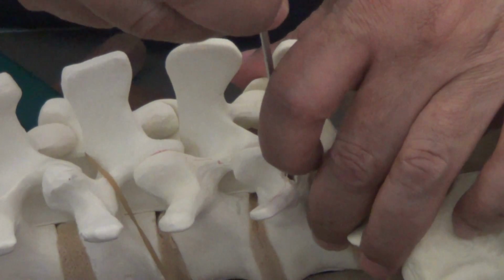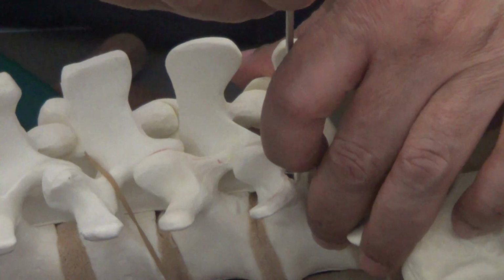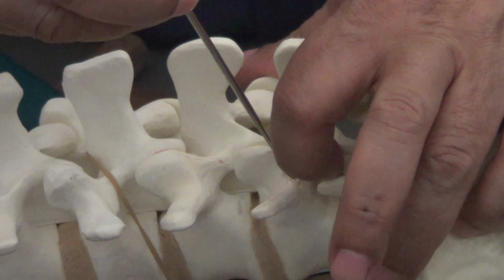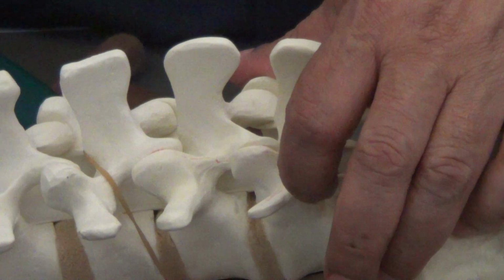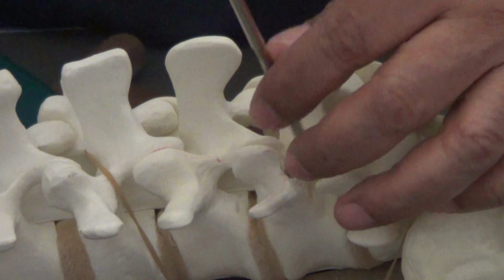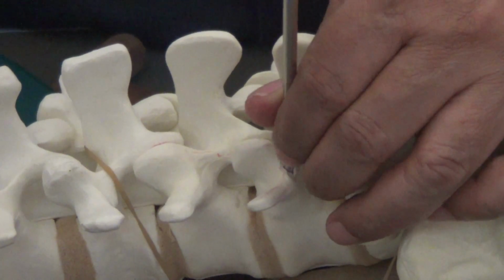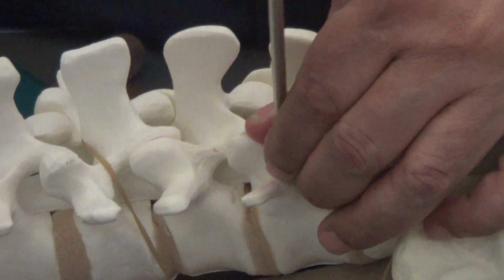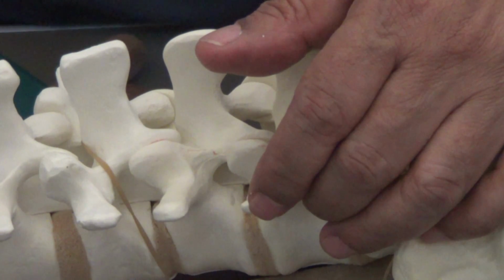If you penetrate the medial border, then you land up in the canal, right? If you penetrate the inferior border, then you land up in the foramina, and the nerve root is there. It's very important to palpate your borders, then further go down classically, and you have some special awls like the Lenke's awl, which let you move around, but by and large it is the preference of the surgeon.